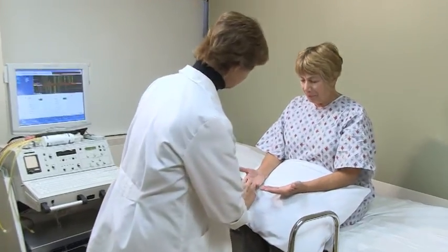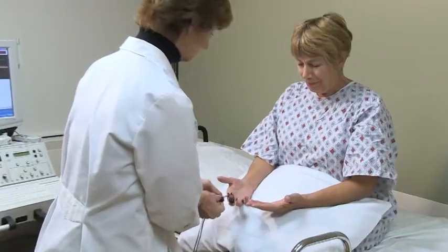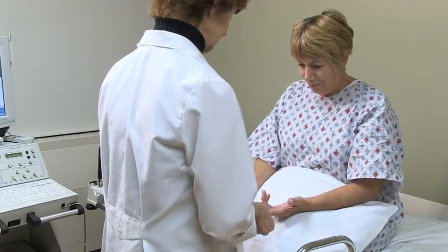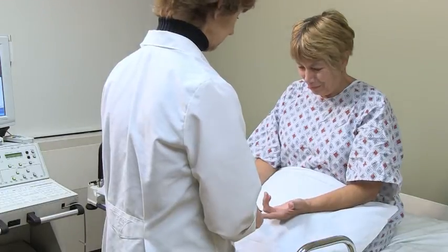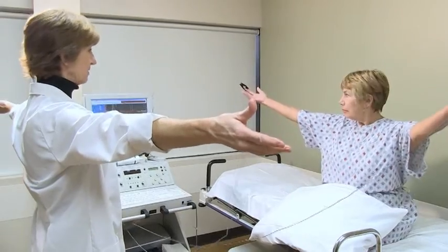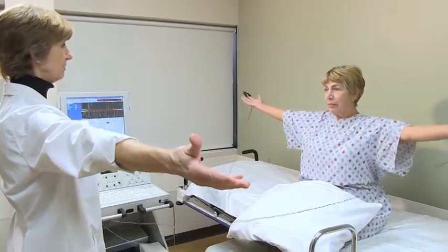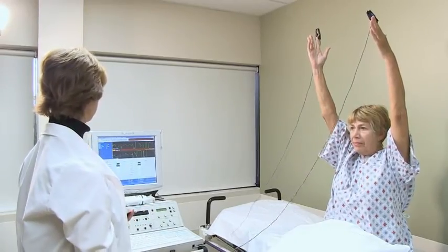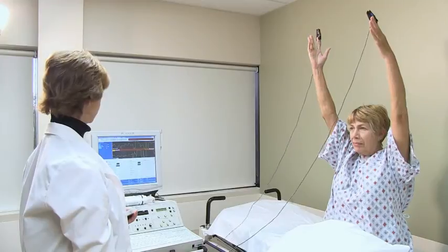The technologist will then place a tiny probe that emits light on the tips of your finger and will record a waveform. While the probe is attached to the tip of your finger, the technologist will instruct you through a series of arm maneuvers. During these maneuvers, waveforms in your fingertips will be recorded.